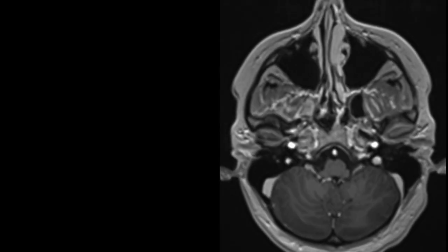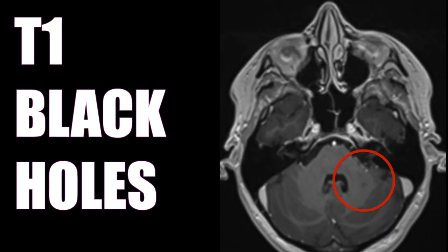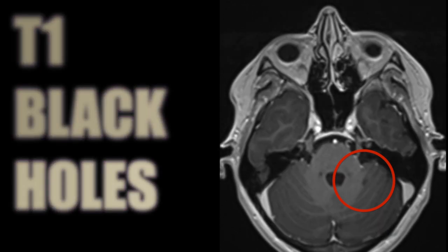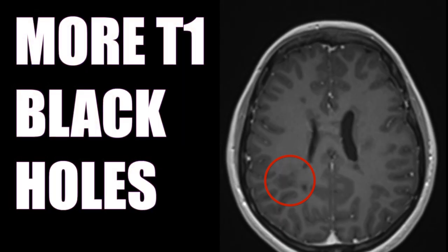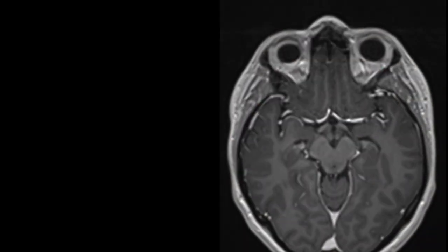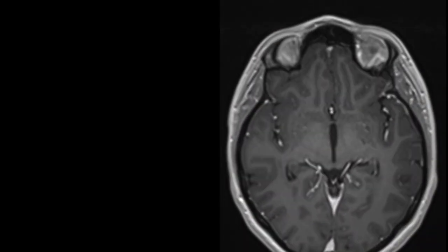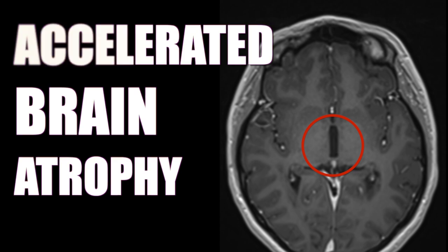The new scan did reveal however several new T1 black holes — areas where the periods of inflammation were so severe that they literally ate away at the tissue of the brain, leaving literally a black hole. It's also important to note that on the follow-up scan we appreciate accelerated brain volume loss, or accelerated brain atrophy. Here in red you see the third ventricle — in a woman this age that space should be closed, and yet it's pretty broad.